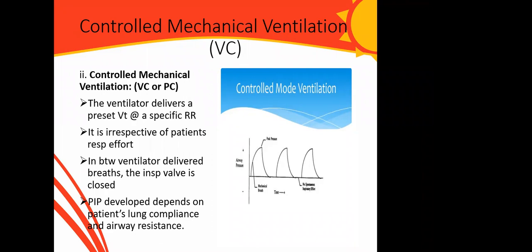In controlled mechanical ventilation, as you can see on the right side of the screen, there is no patient inspiratory effort in this mode of ventilation. So in between, the ventilator delivers breaths. At this point, the inspiratory valve is closed, so the patient can't take in any breath.